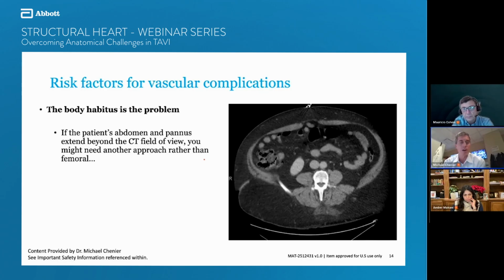And in regards to the patient with the prior surgical aortic valve with the aortic graft kink, that's exactly what we did. We went with a left subclavian approach for that patient. We had to use a snare to pull in, and we were able to successfully deploy, and also had to use a stiff buddy wire just to help navigate those turns.